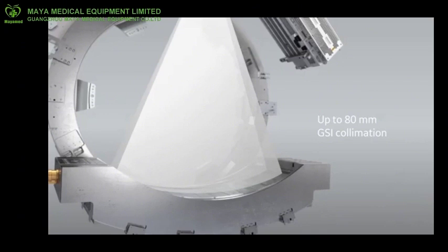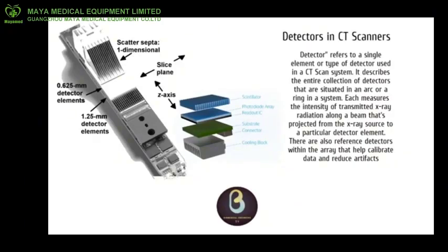And the last but not least component are the detectors. The detectors are components of CT scan machines which collect information regarding the degree to which each anatomic structure attenuated the beam. In conventional radiography, we use a film screen system to record the attenuated information. In CT, we use detectors to collect the information.